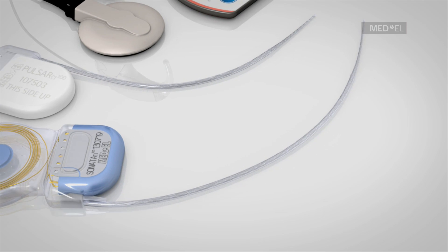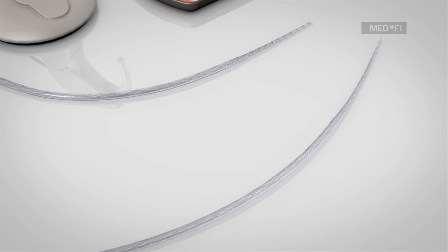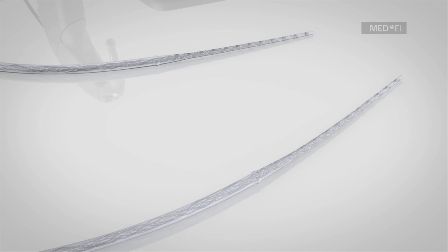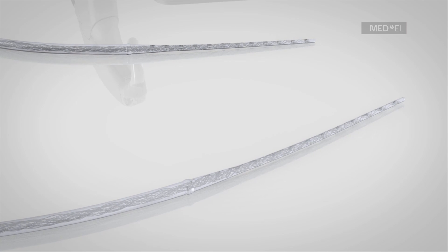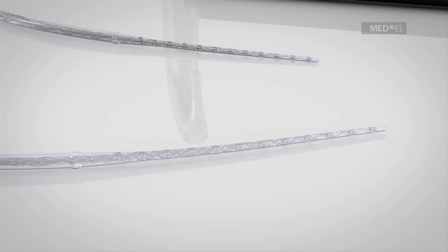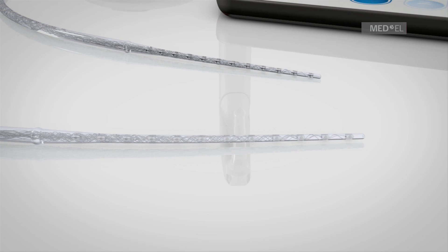The especially long and flexible electrodes were developed specifically for atraumatic insertion deep into the cochlea. Longer, softer electrodes for complete cochlear coverage maximize the entire potential of the cochlea, offering users, for the first time, access to the fine details of sound.